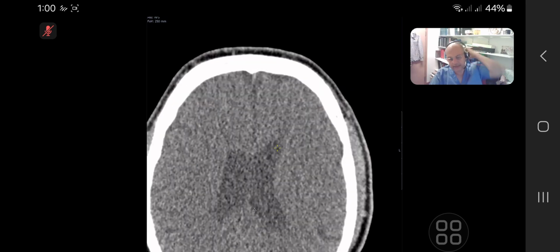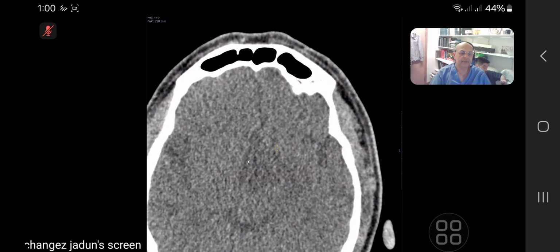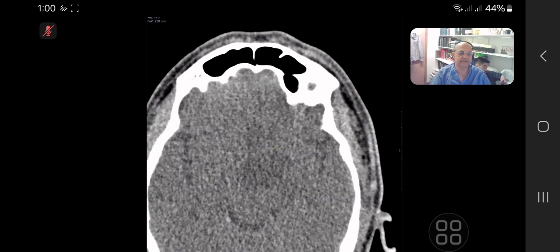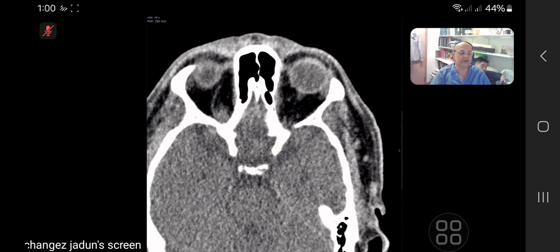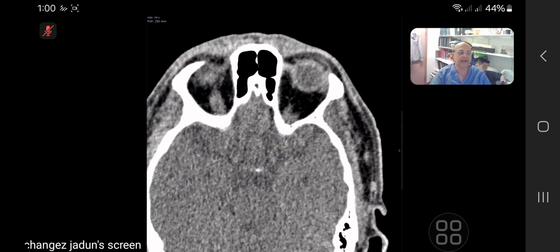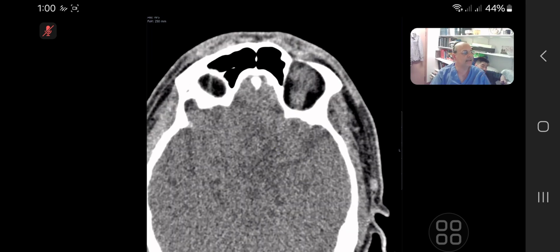Okay, I will help you here in view of the time. What you see here is that there is low attenuation in this area. There is no CSF visible, low attenuation change, and the rest of the findings we discussed, nothing in the orbits. So you tell the examiner, I can't take this further. However, I suspect there is a problem in this area and we should consider an MRI because the patient is losing vision fast and we want to see what is going on in this region.